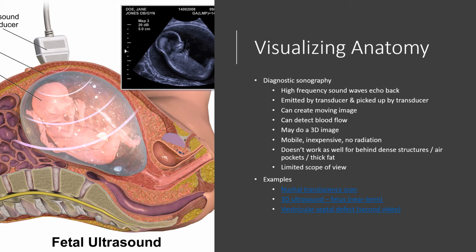An ultrasound, or diagnostic sonography, involves sound waves. What you're going to do is use a transducer right here that emits sound waves, boom, boom, boom, boom, boom, and when it hits stuff, the sound waves bounce back, and it also picks up those sound waves. So that transducer is a two-way structure.